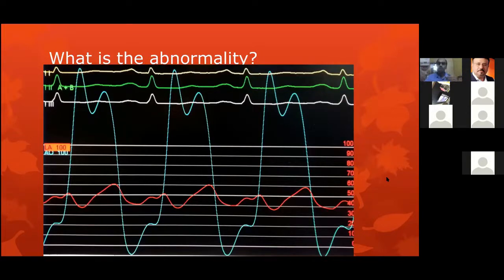So if you palpate the carotid and inspect the JVP in parallel, the giant A wave is pre-systolic, while the cannon wave is along with the carotid. Carotid and cannon are simultaneous; with the giant A wave, the A wave is earlier and the carotid is later.